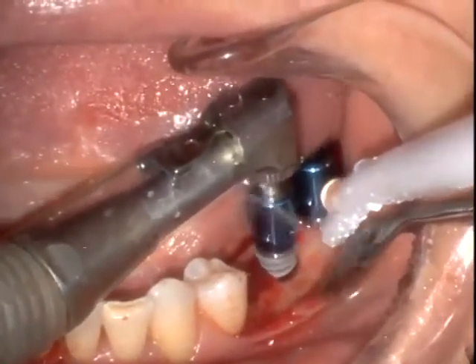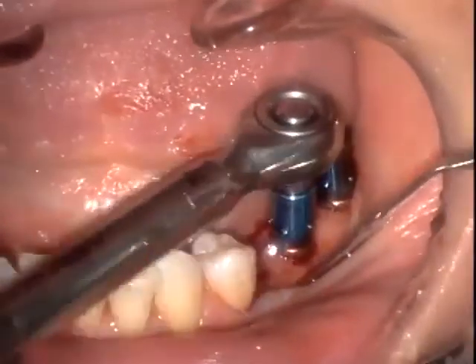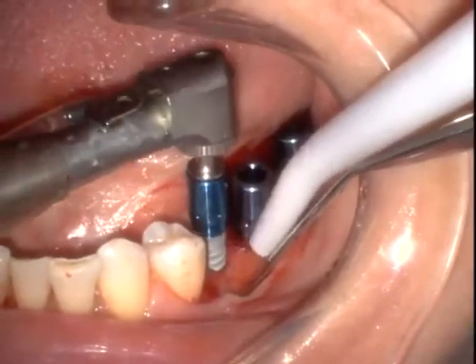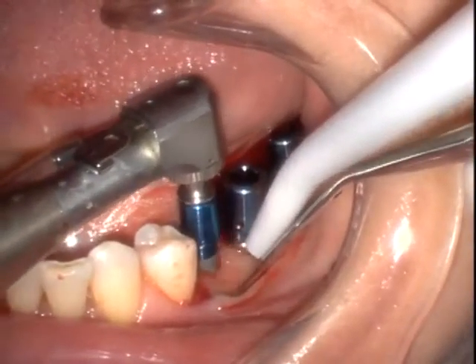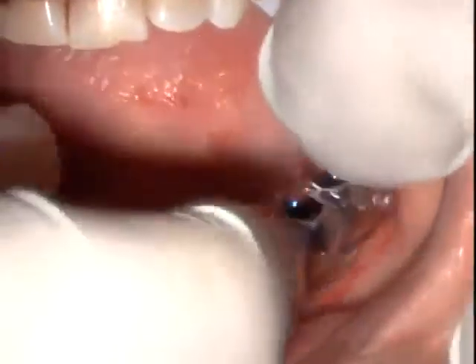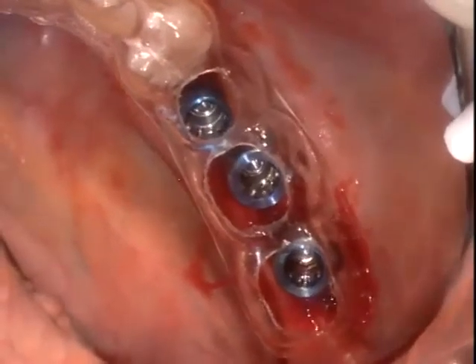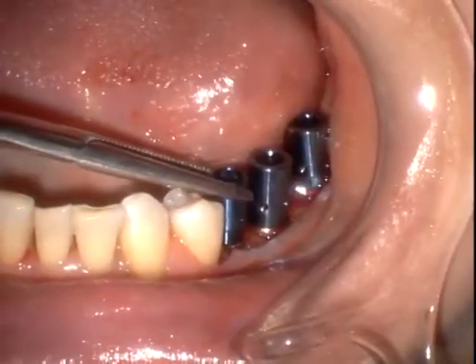In the area of the first molar, a 5 millimeter by 8.5 millimeter length implant is inserted, and you can see that we have excellent bone stability, and we ratchet down these implants to beyond 40 Newton centimeters of initial torque insertion value. In the second bicuspid area, we're going to insert a 3.75 millimeter by 10 millimeter long implant, and we again verify the screw access channels and abutment locations will coincide with the future restorations.